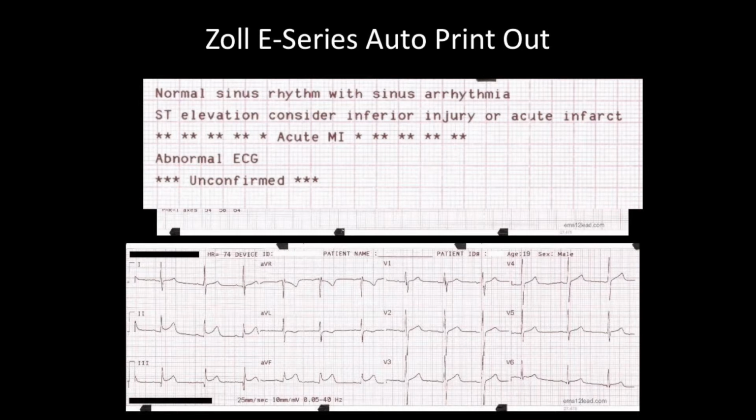This is not for you to now relate, oh, you're having an MI. No. It is for you to say, shit, they're having an MI. Where's the AED? Where's my suction unit? My BVM is ready, all of that. I want to be ready if they go into cardiac arrest. Okay? But we're still not doing anything until we hear from medical control where we're going to go.